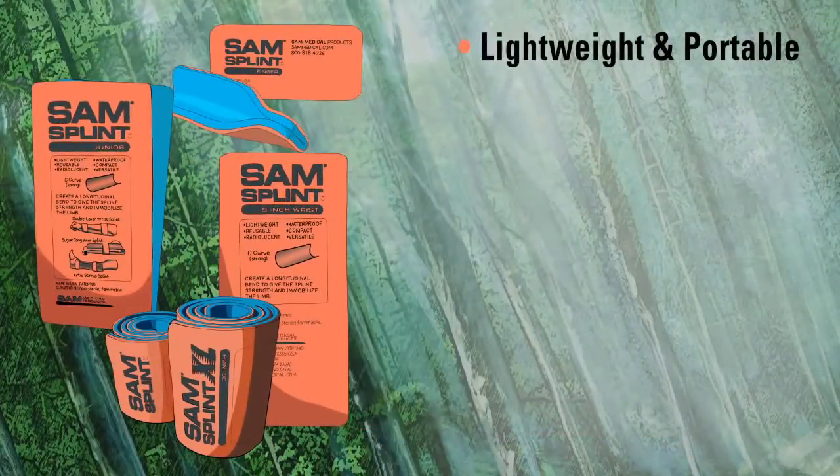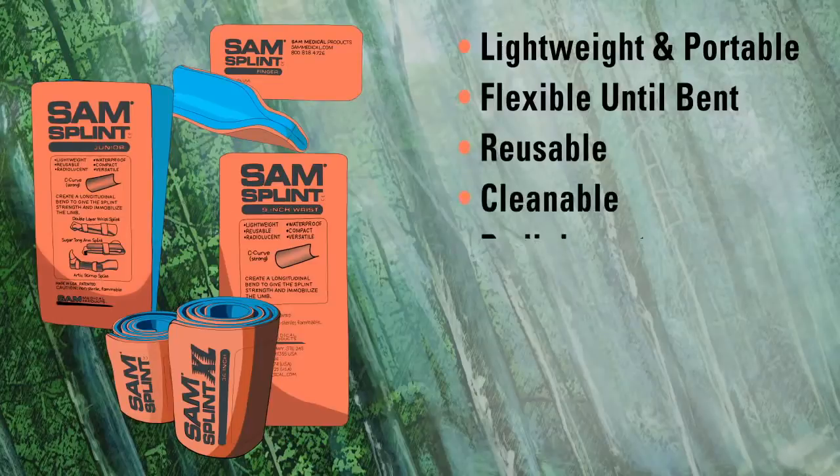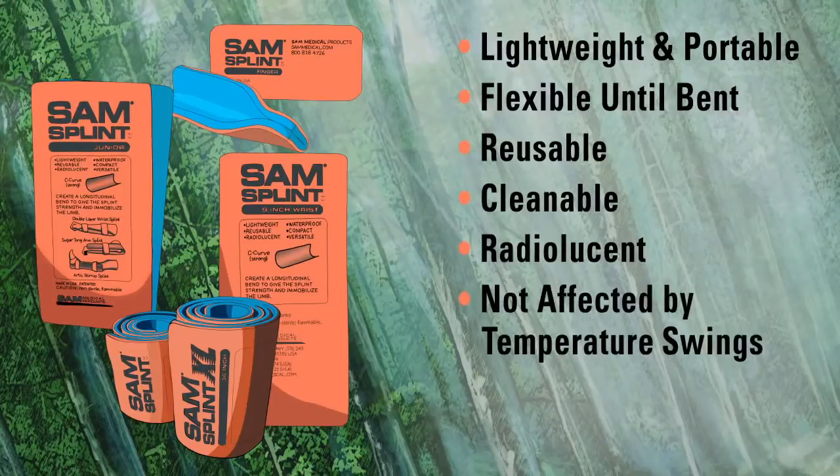SAM splints are lightweight and portable, and flexible until they're bent. They are reusable, cleanable, radiolucent for x-rays, and not affected by temperature swings.